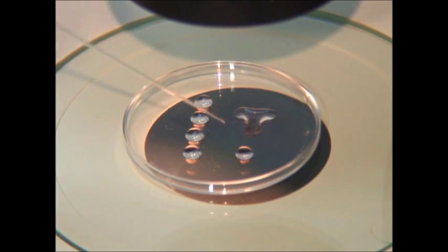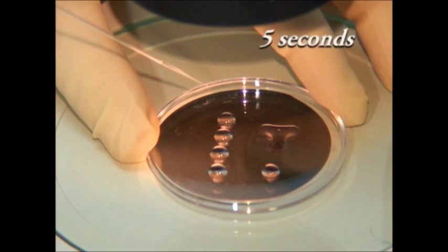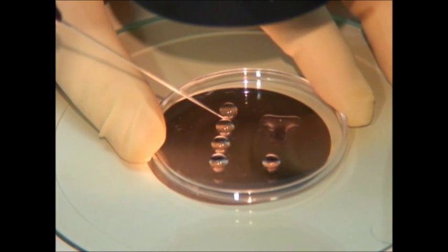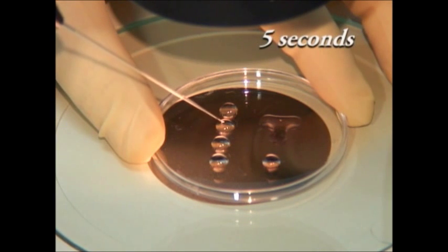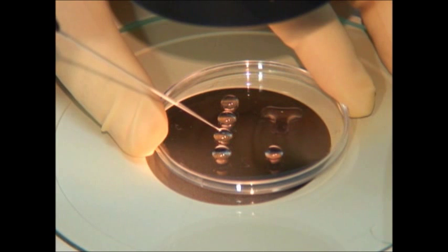During this time, four 20 microliter drops of vitrification solution is allocated in the bottom part of the dish. Next, the eggs are prepared from the third drop of equilibration solution and rinsed in the four vitrification solution drops - five seconds in the first drop, five seconds in the second drop, 10 seconds in the third drop, and then transferred into the fourth drop.